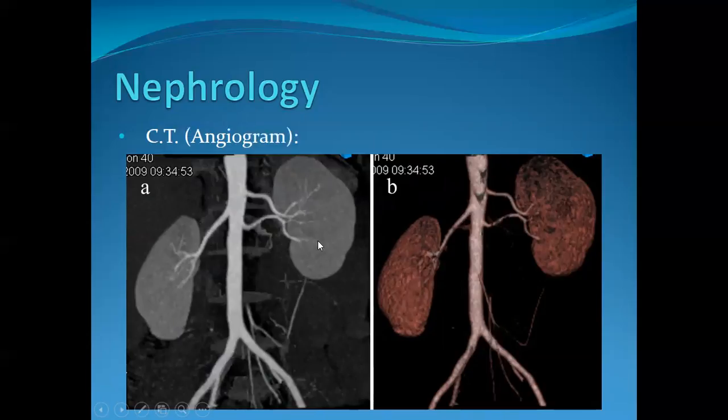Now, you can also do an MR angio of the renal arteries. That's completely possible, and it's a good study. I read a lot of those, or used to read a lot of them, and they're good for evaluating for renal artery stenosis. They're not nearly as detailed compared to a CTA, in my opinion, and it's usually a longer study for the patient to lay there.